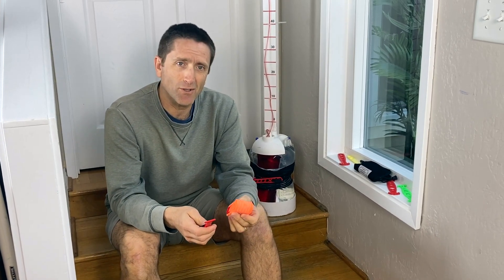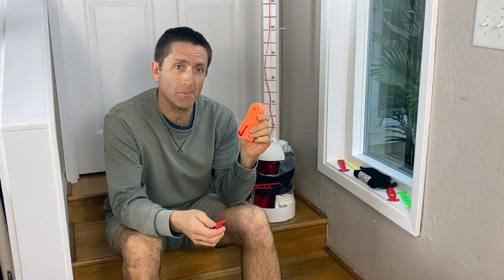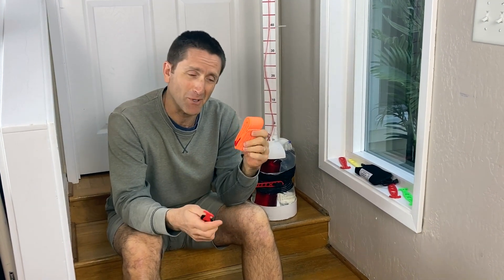Hi my friends, Dr. Sam Slishman here. What I want to show you today is how to turn a Slishman pressure wrap into a tourniquet wrap windlass hybrid.